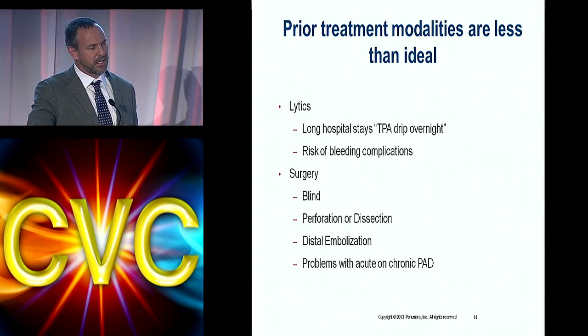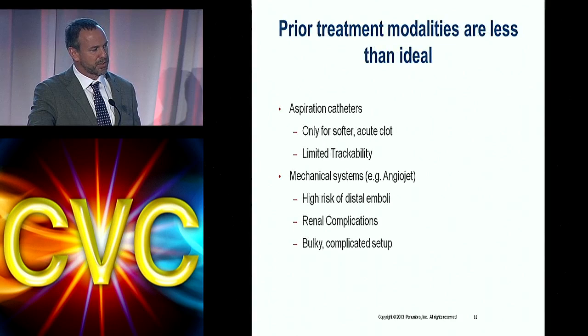However, in these cases, I found it actually works quite well even without the use of thrombolytics. That's really why I've gotten on board. Surgery certainly has its options as well, and as a surgeon, I do embolectomies all the time. But it's sort of a long, drawn-out procedure, and this sort of avoids the incision.